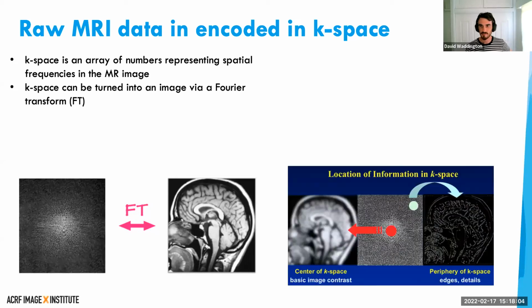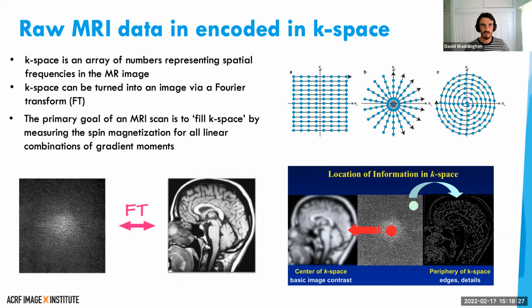And so basically what we find is that as we fill K-space, we can then get all sorts of information. For those who've studied these kinds of problems, you can see that different parts of the K-space can contain different bits of information about the images that we reconstruct. And in MRI, there are all kinds of crazy ways to combine these things, what we call different trajectories, all sorts of ways to sample our information.